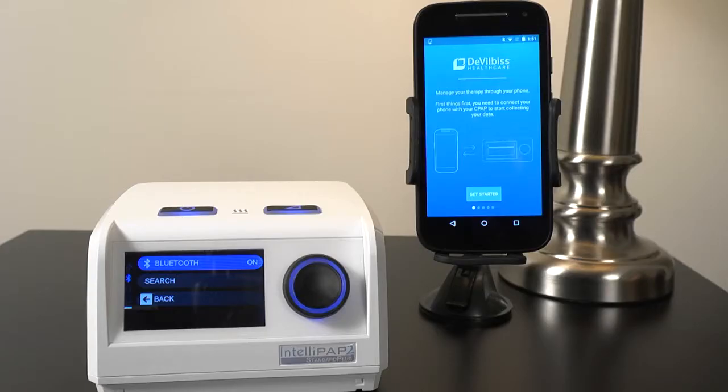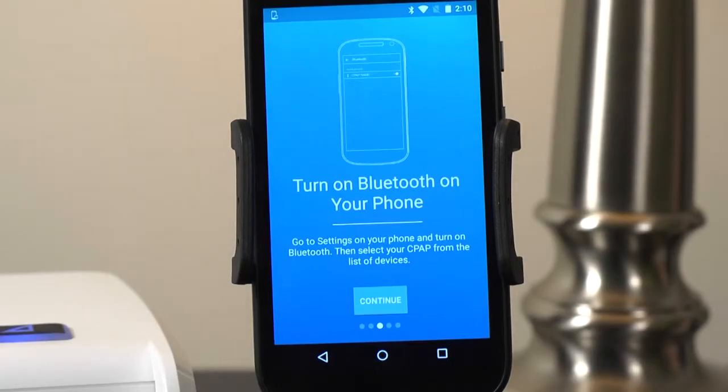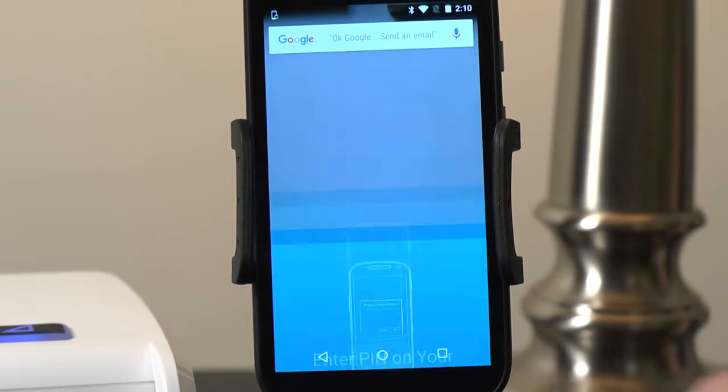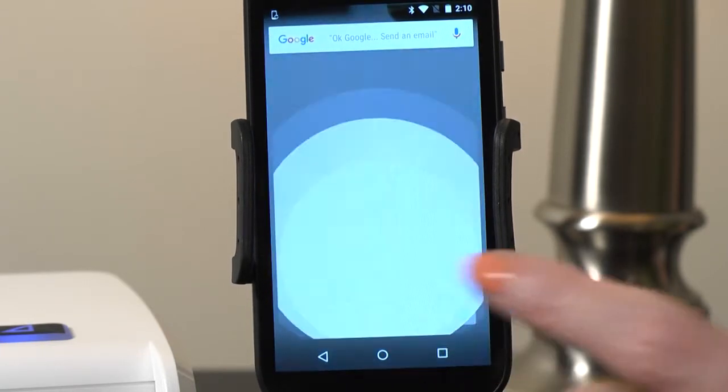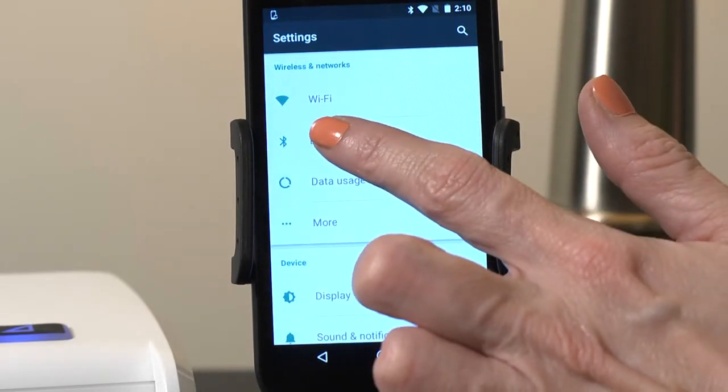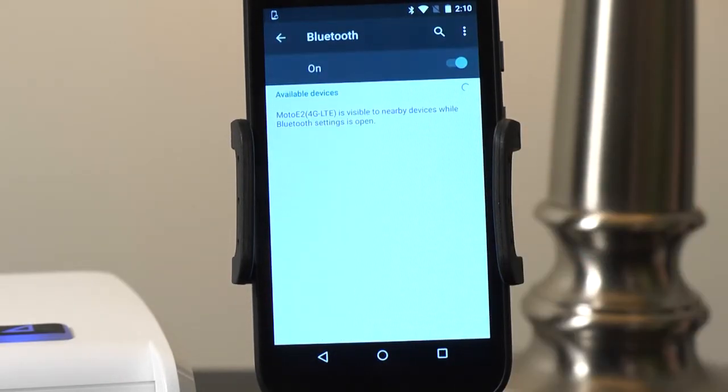Ensure the Bluetooth on your Android device is set to On. Then, on your Android device continue to the next screen and your PIN will automatically copy to your clipboard. Next, go to Settings and then to Bluetooth and your Android device will show a list of Bluetooth devices in range.